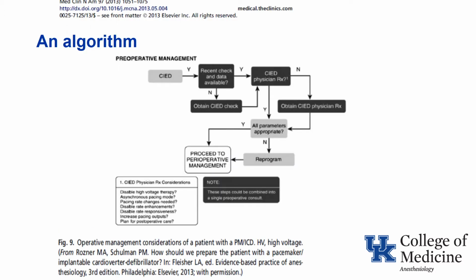Now here's an algorithm, and on this algorithm you see reference to a CIED physician in the preoperative management, and this refers back to the recommendation that there be an institutional solution for these devices.